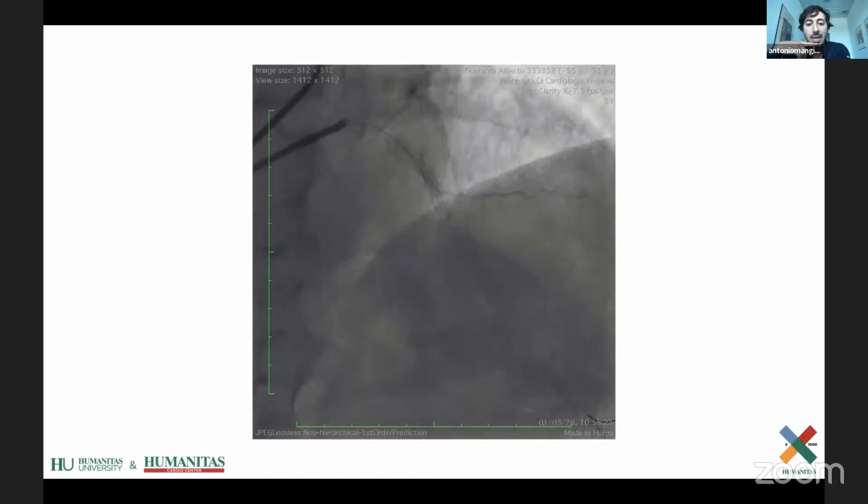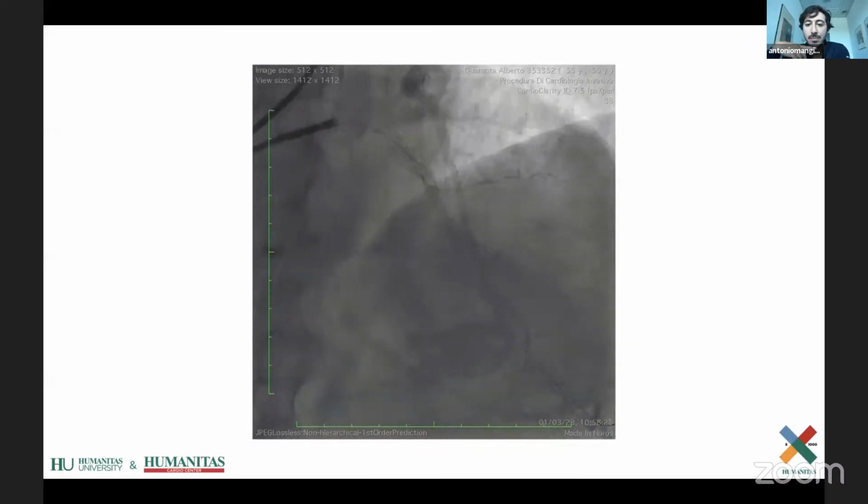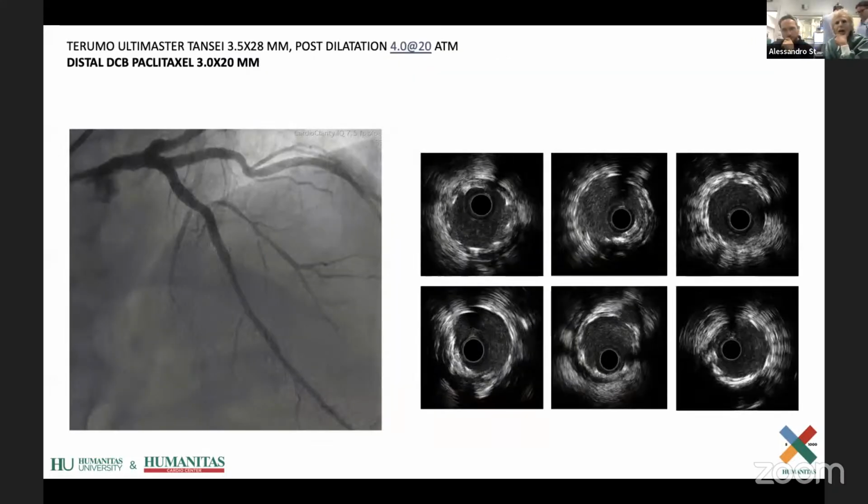But I agree with you that the thing to do in this case is a kissing balloon, maybe with a DCB is a good idea. Yeah. Good, as long as you tried. Now we're happy. Very wise, Antonio.